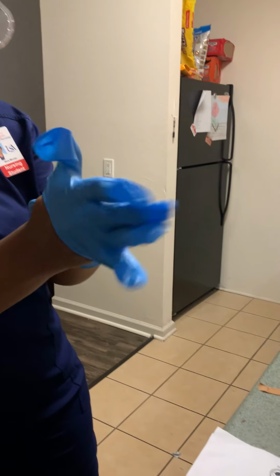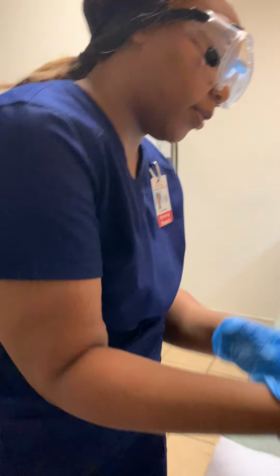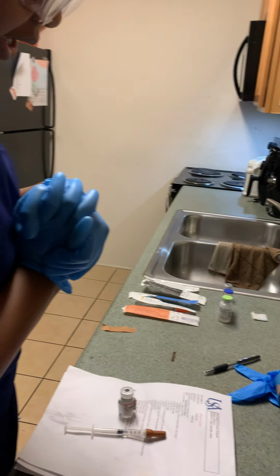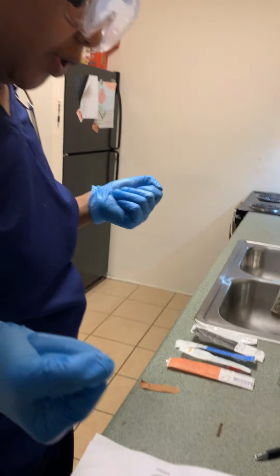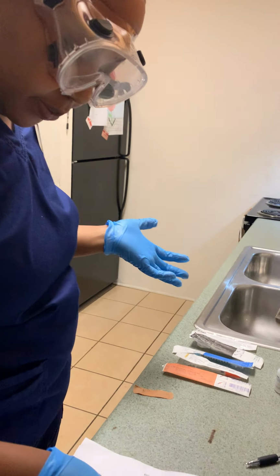I also do not have an injection pad, so I will be using this as the patient, but I know that I will inject it 2 inches from the umbilicus on the left or right side. I will raise the bed up to a level working height. I will lower the bed rails and make sure that my patient is comfortable.